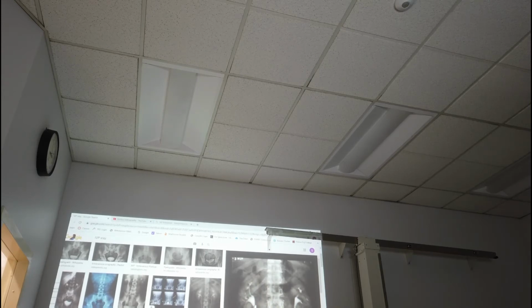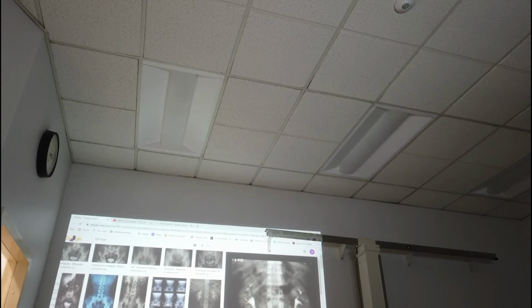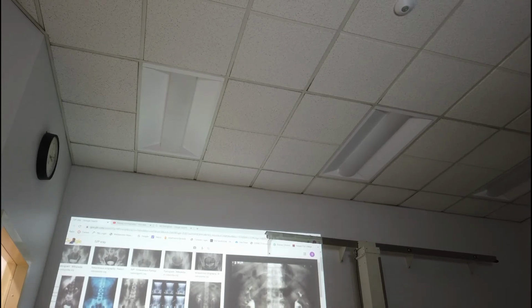Is there a picture of it? It's just labeled like elevated, that's demonstrated. Oh, the elevated side, the demonstrated side? Yeah, the upside, basically. The demonstrated kidney side. Right, and then that's demonstrated on the ureter, on the downside. Oh, okay, yeah, that's correct.